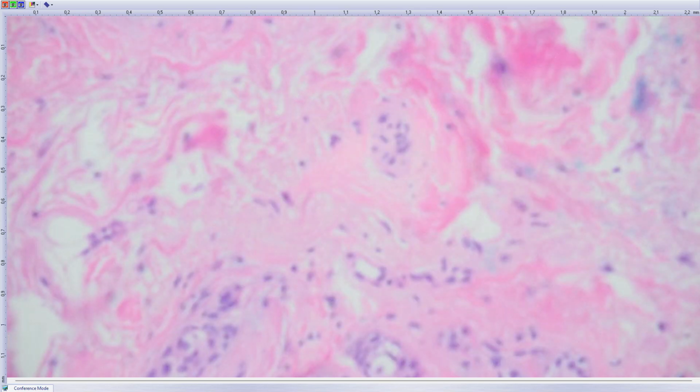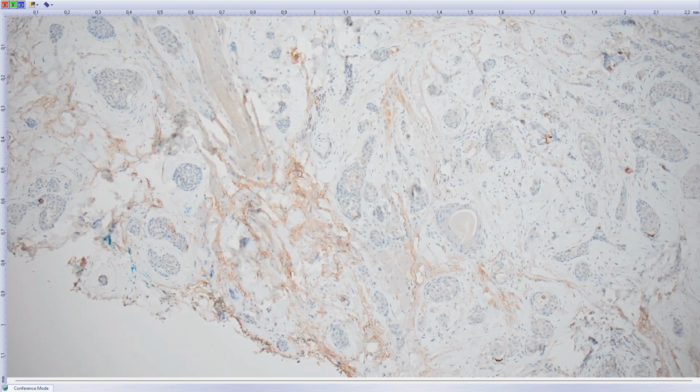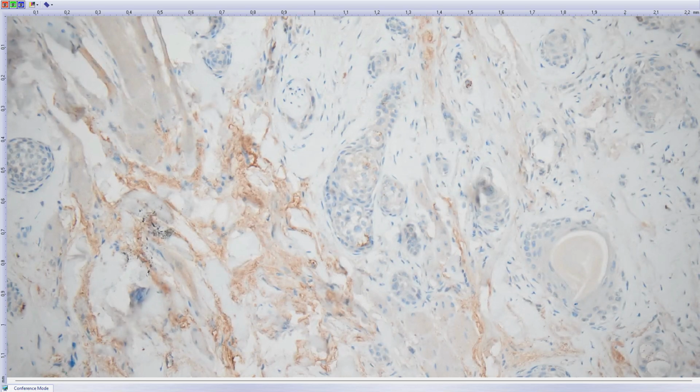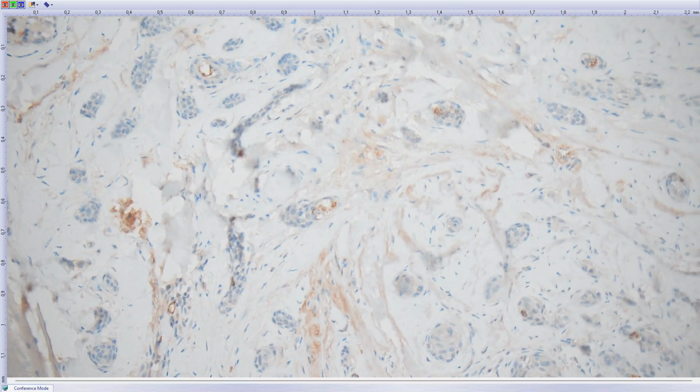It's not very well seen in detail, but for these clear cells, we looked at adipophilin. It's quite apparent that these clear cells, like the one in the middle, are adipophilin positive.